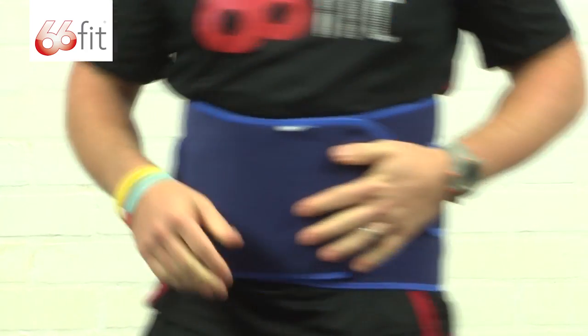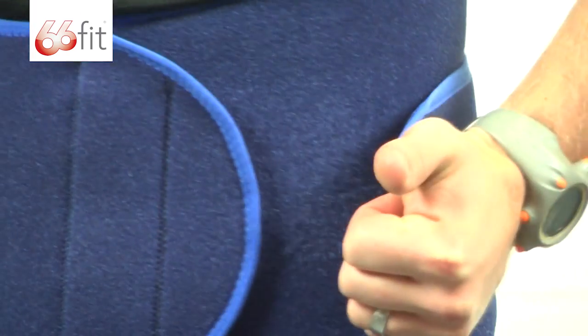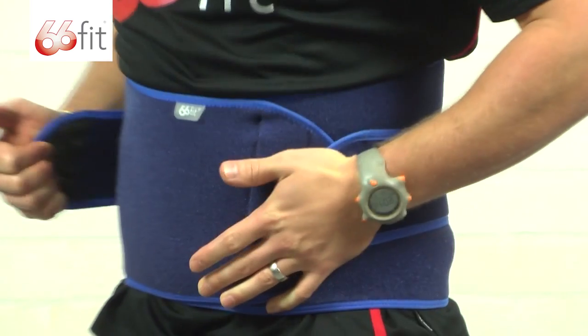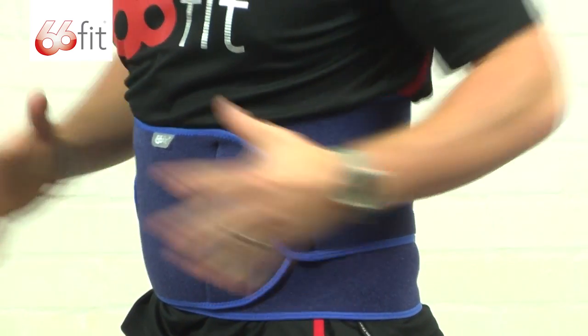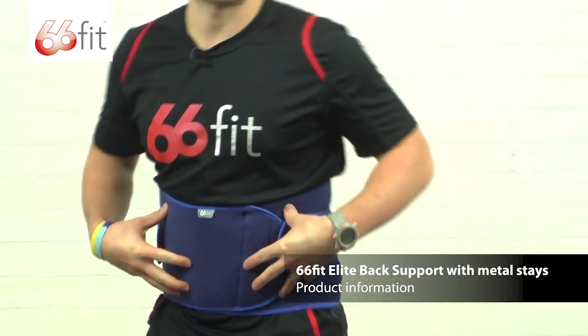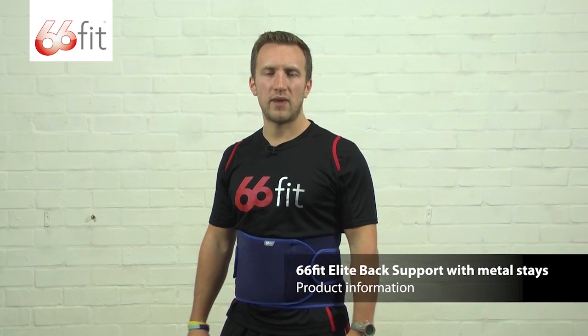Now one other extra feature that this particular brace has got is the additional support and adjustment with these flaps. I'll just turn side on so you can see. Take them, pull them round, just stick them in place — really pulling nice and tight — to keep those muscles warm in your lower back. This particular brace is a one size fits all and it's suitable for both men and women.